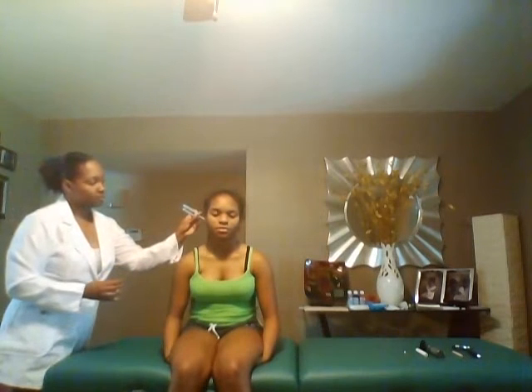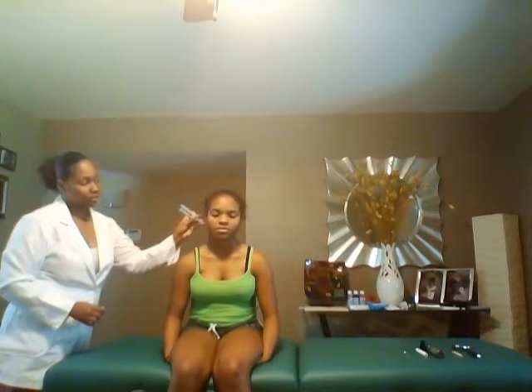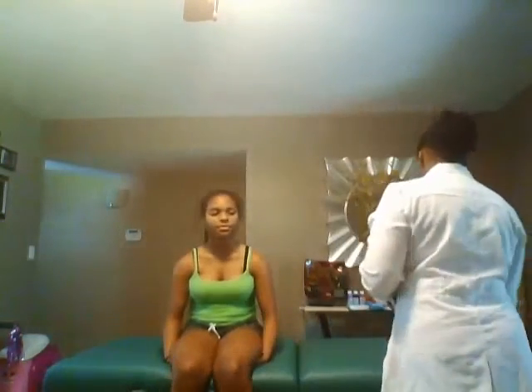And now I'll do the Rinne test. And as I strike the fork, I'll put it on your mastoid process. And you tell me when you stop hearing the vibration. And I put it in front of her external ear canal. Tell me when you stop hearing the vibration. And then I'll do it to the other side. Okay. And her air conduction is twice as long as her bone conduction.